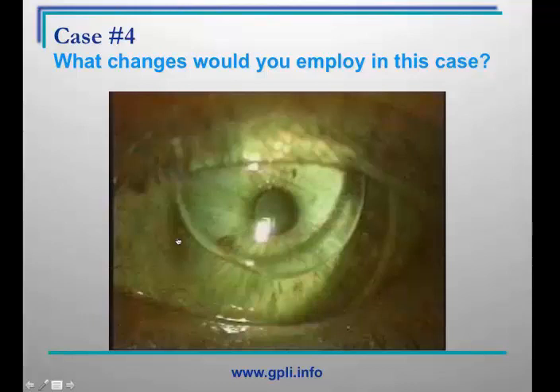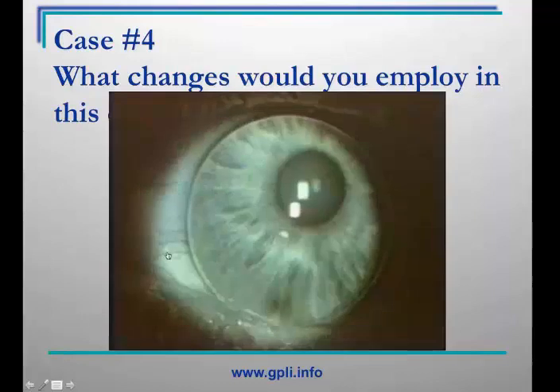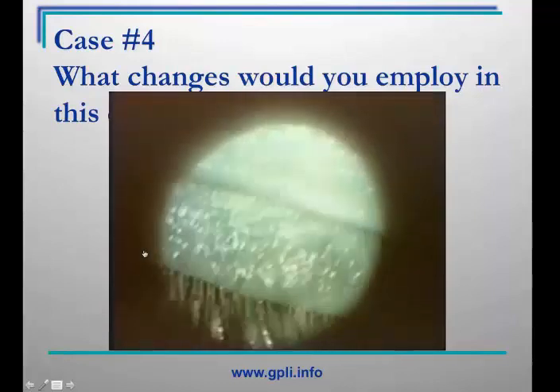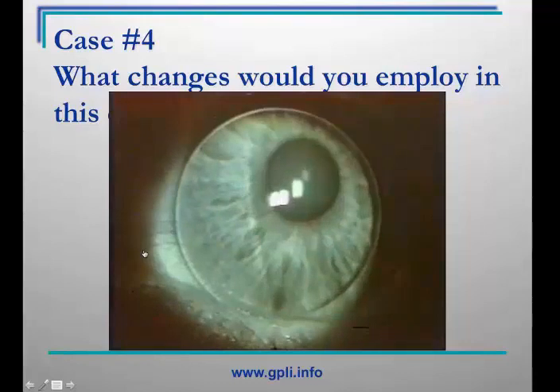Now in this case we have a situation where as the patient blinks, the lens starts rotating. And as I like to say, this is a perfect lens for patients who only want to look to the right. But seriously, in this type of patient, when the lens rotates excessively, oftentimes this is a lens that's fit a little bit too steep.